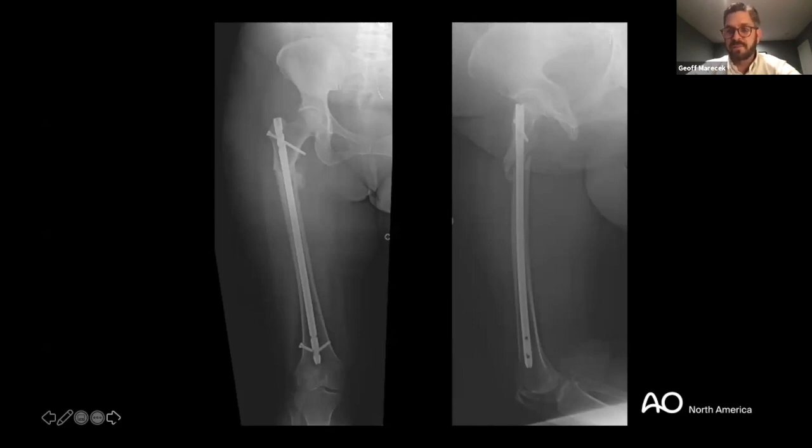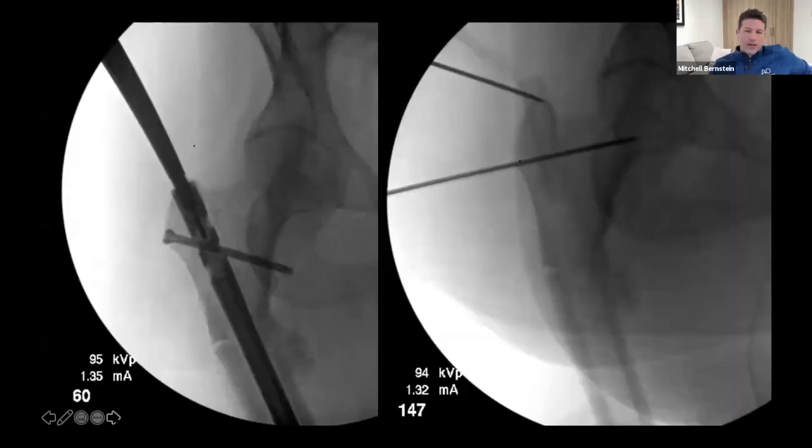I just want to add a point also, because there are a lot of questions about a troch entry nail versus a piriformis entry nail versus the cephalomedullary recon business. The learning point is, like you just said, Jeff, choosing the nail is not necessarily the hardest part.